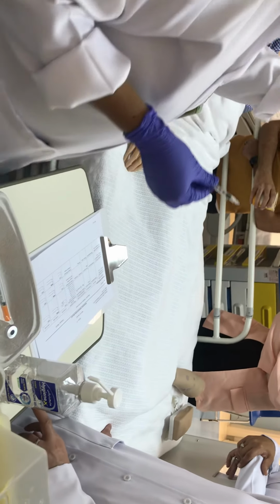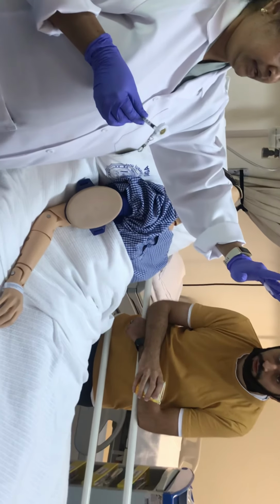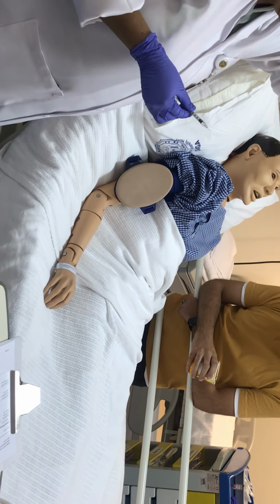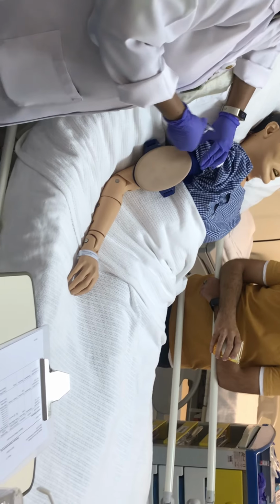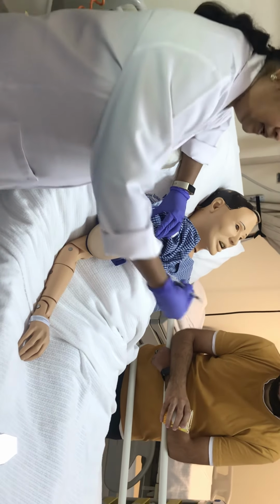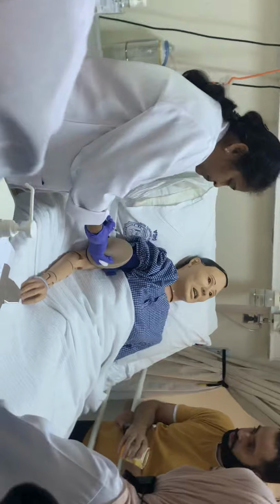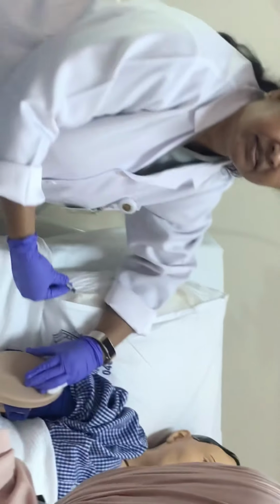I need to have cotton, because at the end of it, usually we tell them to keep it on this finger, which we are not using. Okay, this is my non-dominant hand. I'll show you in both angles. Okay, imagine my patient is very thin. So whenever I want to give at a 45-degree angle, see how I'm holding the syringe. It is easy if I go like that. And some students will try to pinch like this and do. Please don't encourage that. Pinch from above, give from down. It is very easy.